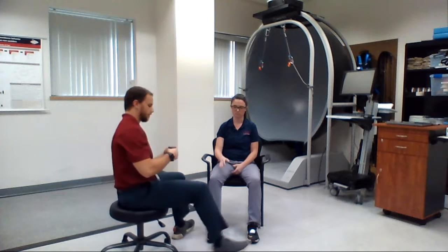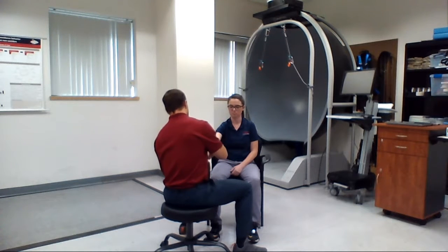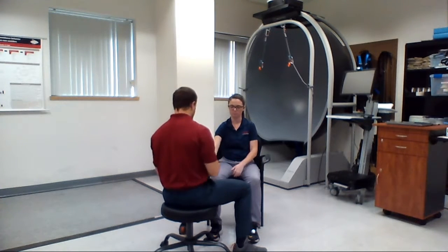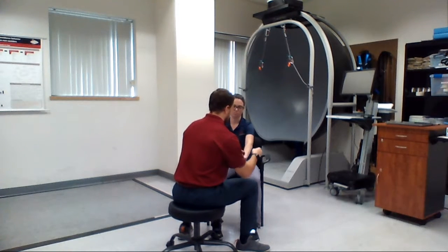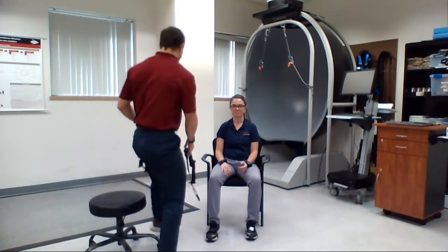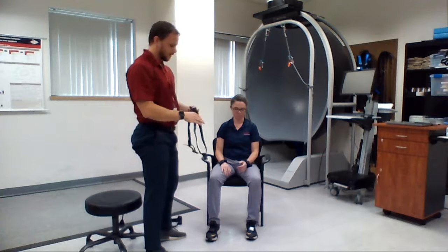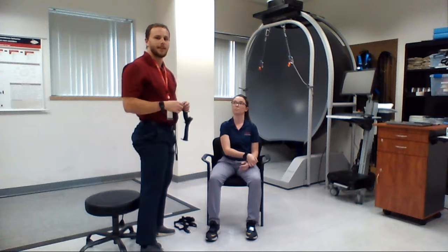The wrist sensors will be put on just like you would a watch. The last two sensors are lumbar and sternum. You'll have the patient standing for these.